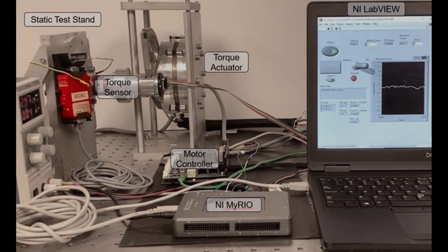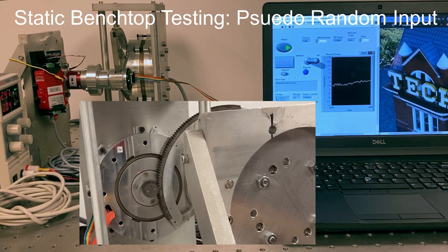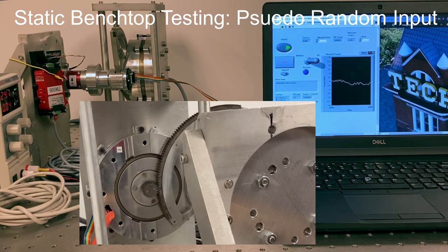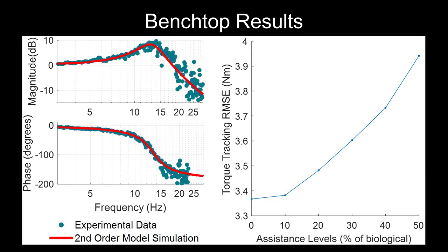We now show examples of our static and dynamic benchtop testing, followed by examples of torque tracking at various speeds and assistance levels.